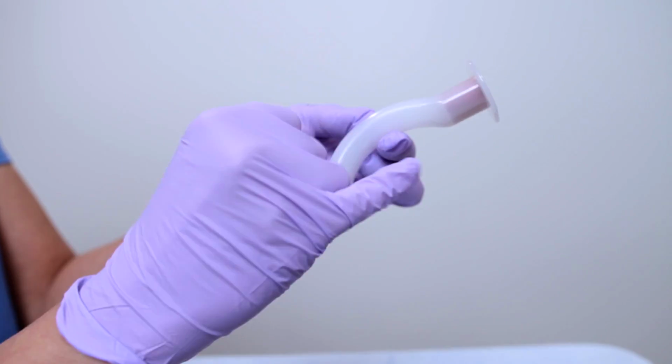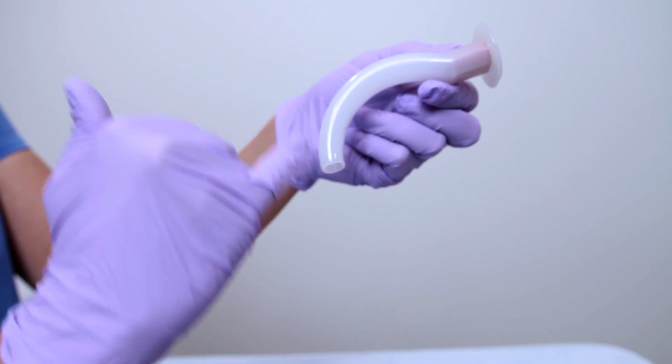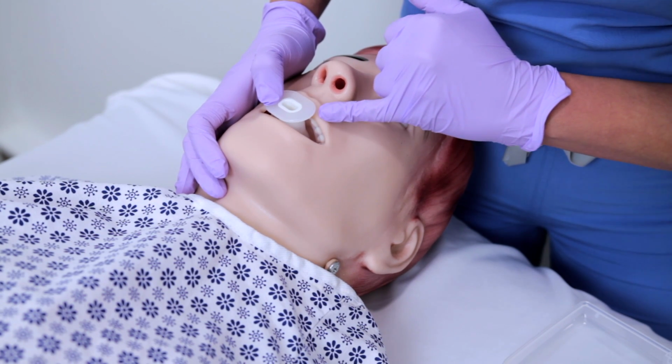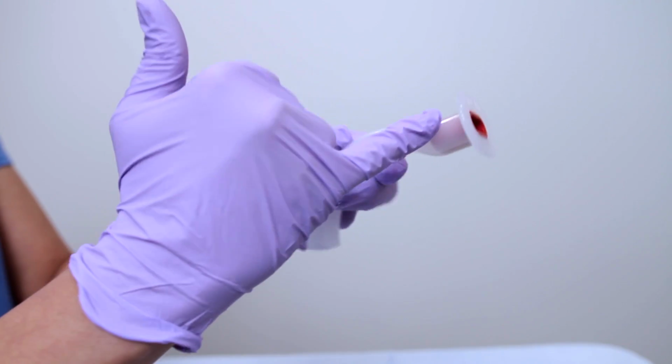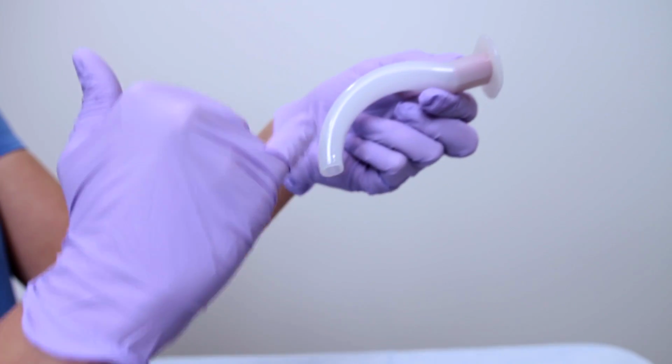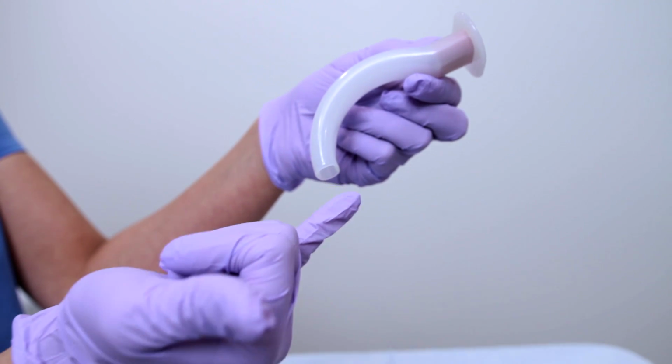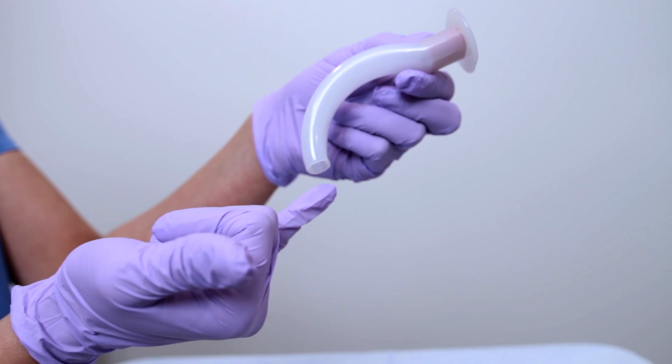The OPA sits on top of the tongue with the opening of the airway sitting at the front teeth and lips of the patient. It has a curved arch to fit over the tongue. Anatomically, the end of the tube sits above the larynx.